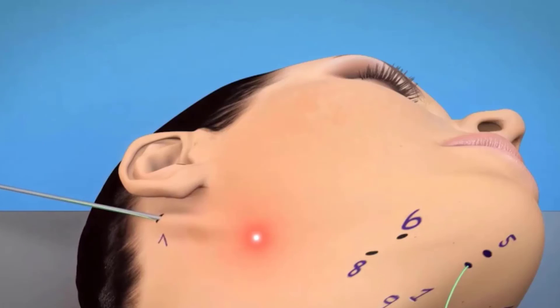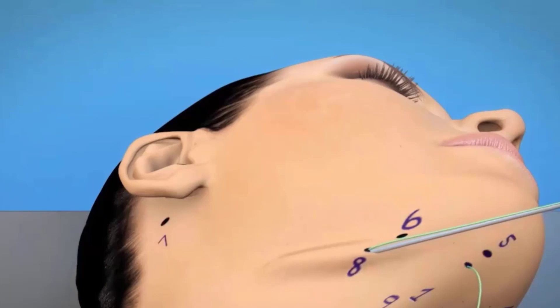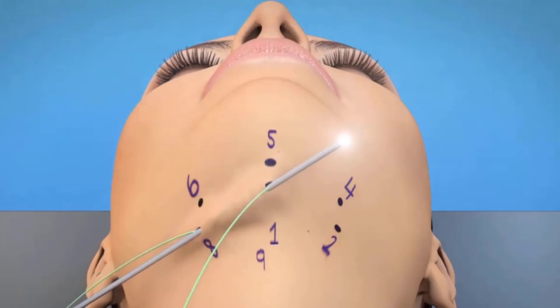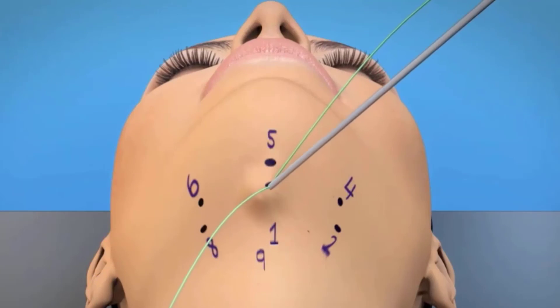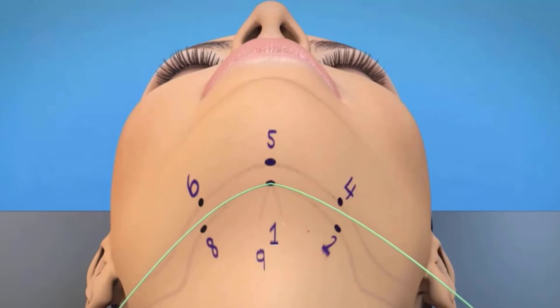The system is then brought out through point 8, the rod will be pivoted in the subcutaneous space, and then will be advanced to point number 9, which corresponds to point number 1 — the original insertion site of the suture. Once the rod is brought out through point number 1 or point number 9, the two suture ends are brought together, and a hemostatic clamp is placed on them. The suture ends are then cut with a scalpel and again secured to a hemostatic clamp.